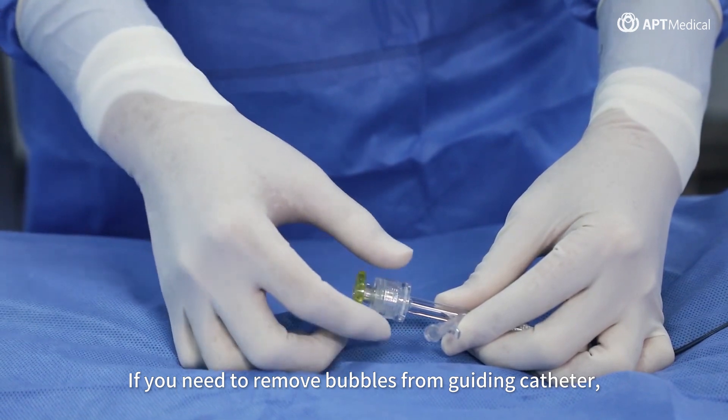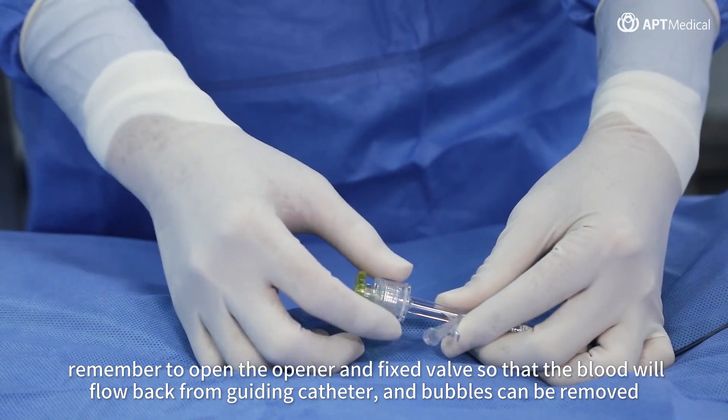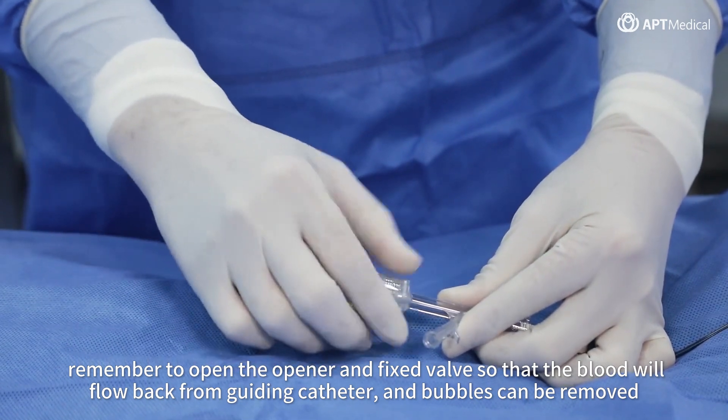If you need to remove bubbles from the guiding catheter, remember to open the opener in the fixed valve so that blood will flow back from the guiding catheter and bubbles can be removed.